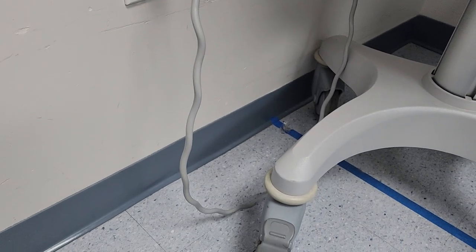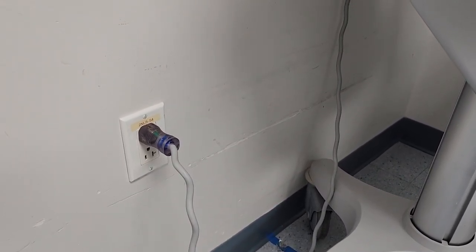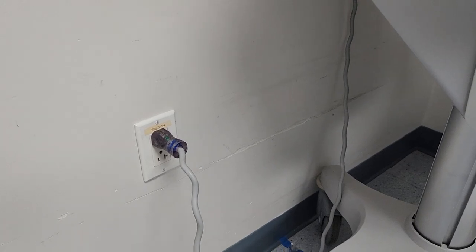If you have a power cord like this on any medical device, remove that cord from service. That is a no-go.